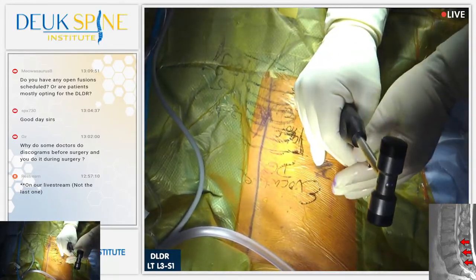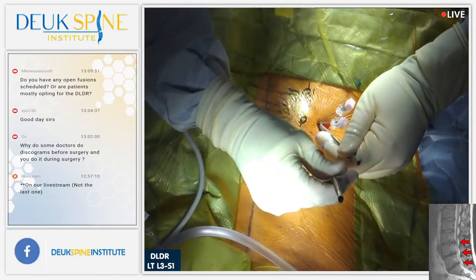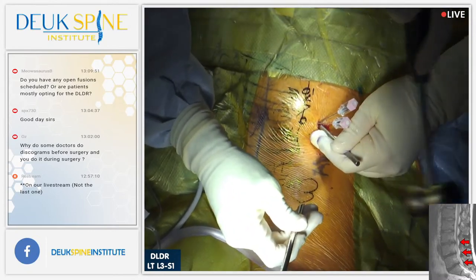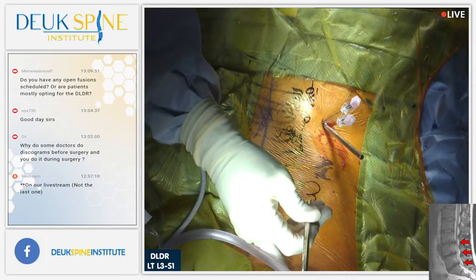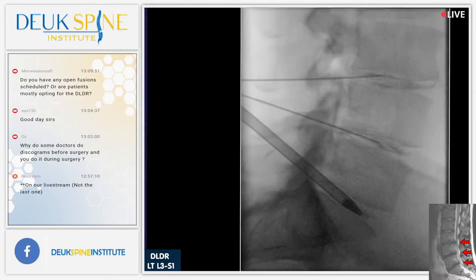Welcome back. We're in the process of getting this L5-S1 disc accessed. I know it looks horrible, me hammering away, but that's how you do it, folks.